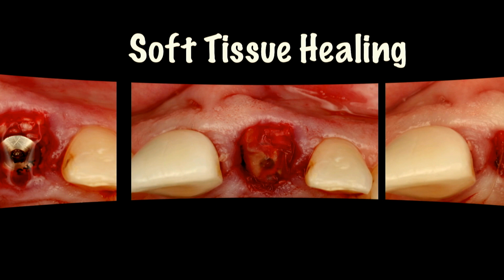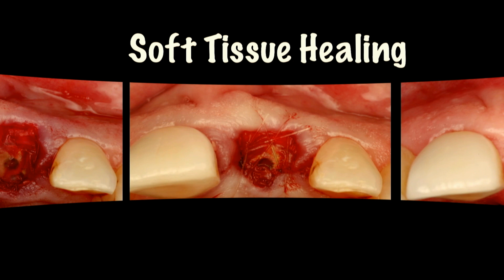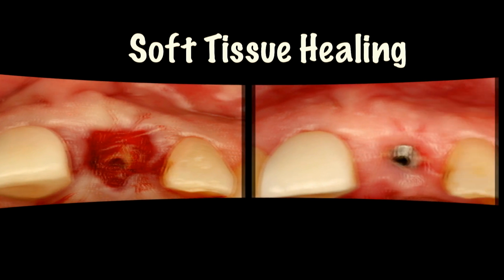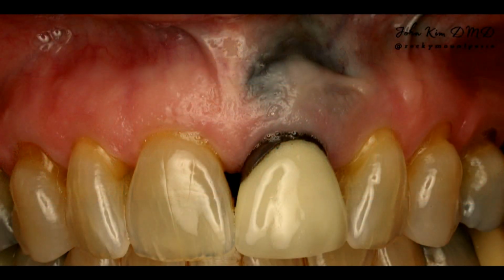And again, sometimes I'll even do almost like an ice cream cone technique with this. So before I put the bone graft in, I'll slide in the Amnion-Chorion in between the buccal plate and the implant, pack it, and then 1 little 6-0 glycolon suture just to hold things in place. You don't want to put tension. You don't want to put any pressure on that buccal plate. But again, that beautiful soft tissue healing at 1 week is what we're looking for. So not only do we get great bone with this, we also get really, really nice soft tissue.